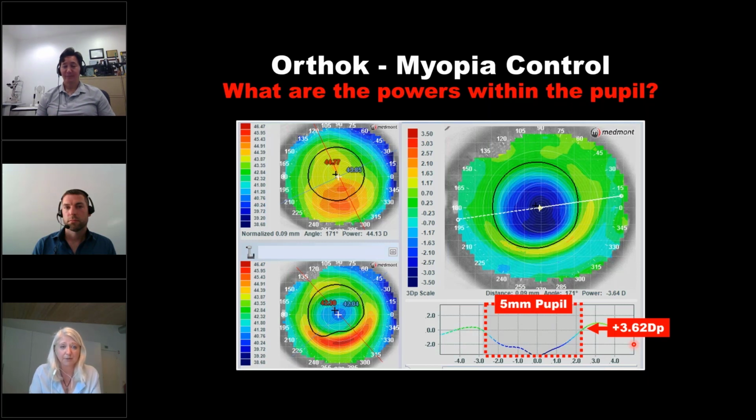It's a balance, because yes, we want as much plus as possible in there, but it also can add some problems to the vision, and those problems tend to be worse the older the patient is. But there are different options. Of course, you can choose between different products, like a soft lens myopia control lens, or you can do Orthok. So it's possible to change the treatment.